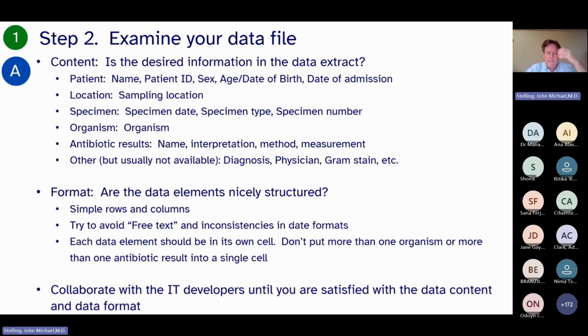Sometimes you say things like, John, WHONET is missing the imipenem. First question, was imipenem in the download? Sometimes if imipenem is added to a lab system, it is automatically included in the download. That's easy. You don't have to do any extra work. Other times, if they set up the export, it is possible the new antibiotics are not included. So whenever anything's missing, the first thing I go back to is to see if the IT people gave you the information in the file.